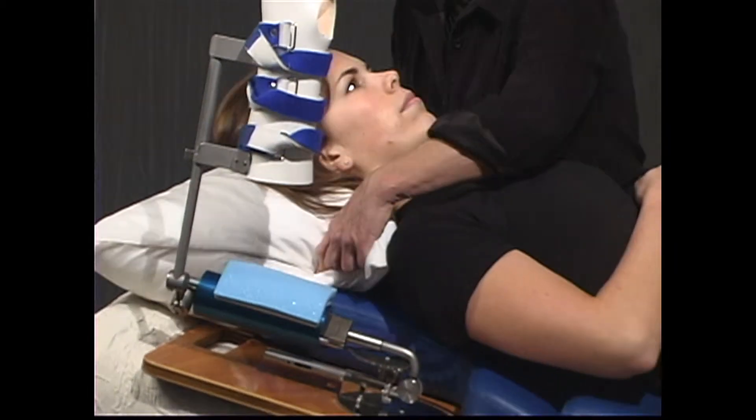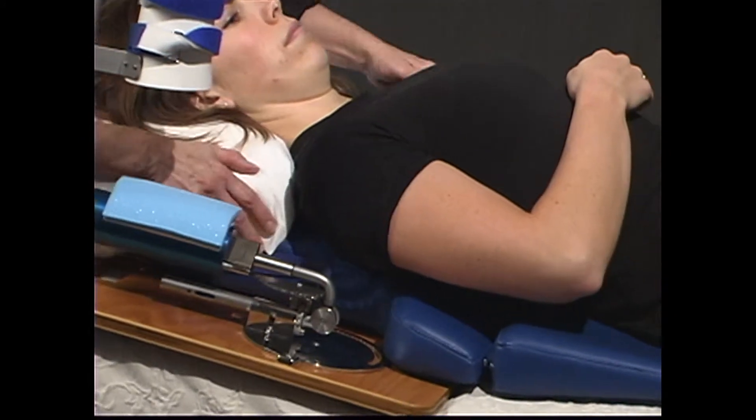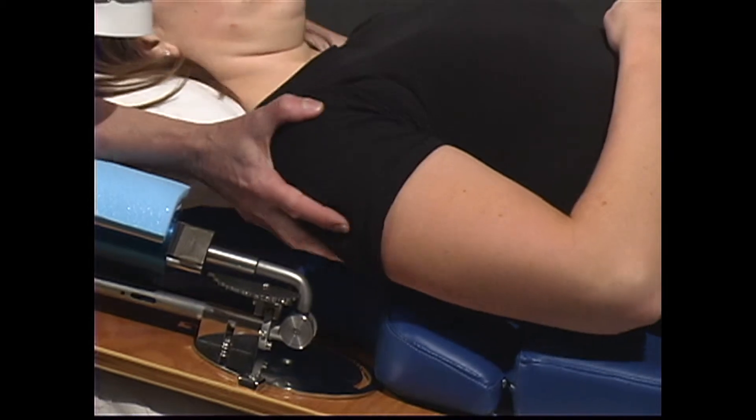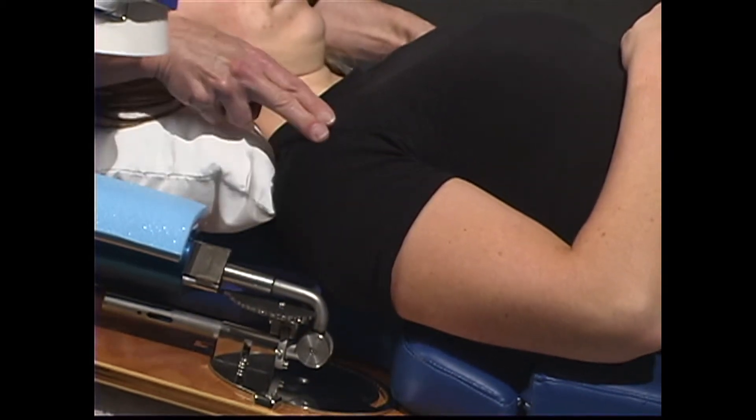If needed, place a pillow under the patient's head for comfort. Position the patient's shoulder in line with the access point at the base of the unit. Place your finger to see if the patient's shoulder is lined up properly with the mechanical shoulder.